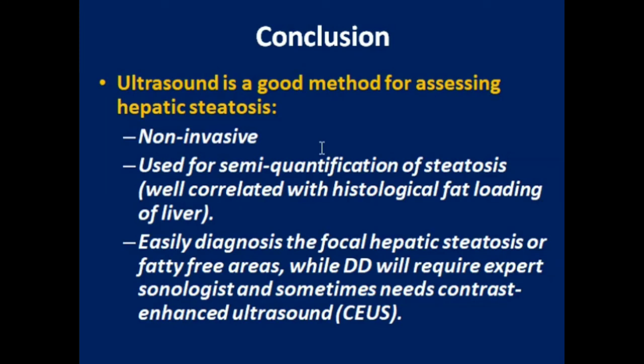To conclude, ultrasound is a good method for assessment of hepatic steatosis because it is non-invasive and used for semi-quantification of steatosis, which correlates well with the histological fat loading of the liver. Ultrasound easily diagnoses focal hepatic steatosis or fatty-free areas, while differential diagnosis will require expert sonologists and sometimes needs contrast-enhanced ultrasound.